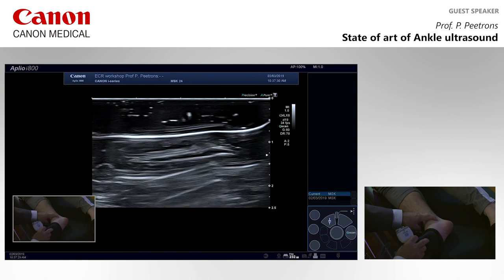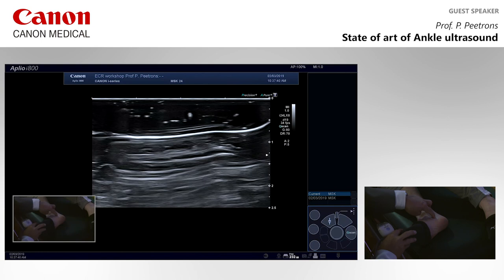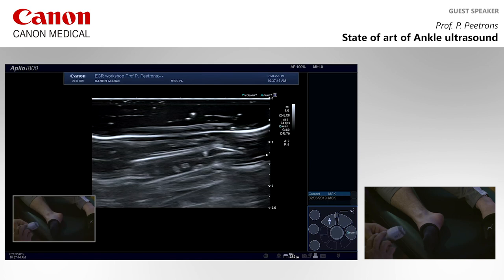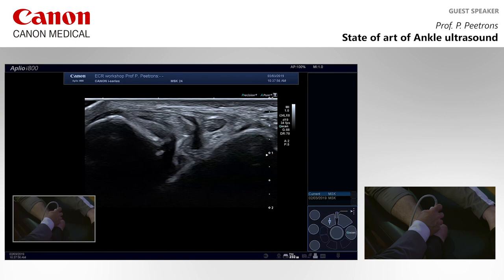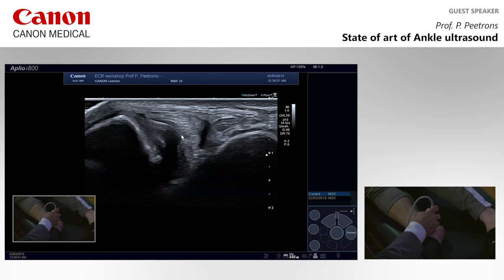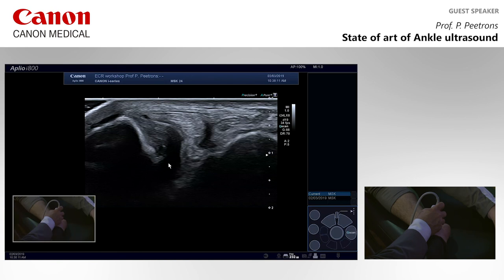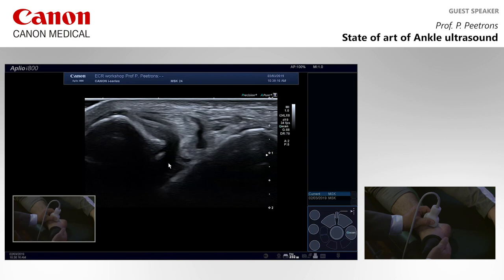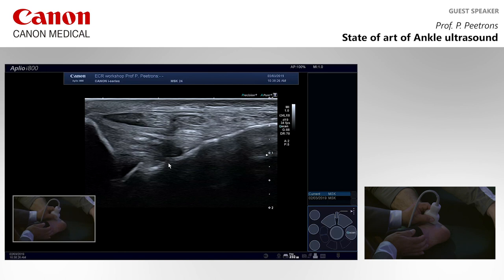Okay? So opening the gate is, of course, doing that. Because the talus is here and the tibia is there. And if I close the gate, the two bones are close together. So I put my probe on the tibia and I'm looking to the talus. Here is the tibia, here is the posterior tibial tendon, here is the talus. And you say, oh, he has a very big deltoid ligament lesion here because this is normal, and then suddenly it goes completely black to the bottom of the image. But if I do this, I stretch the ligament, and you see that there is no gap at all. The ligament is complete, and it has no lesion of the deltoid ligament.